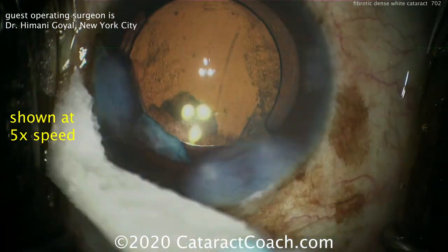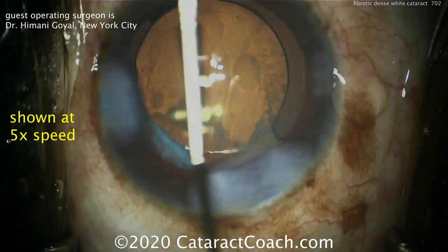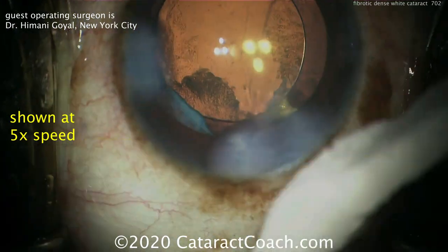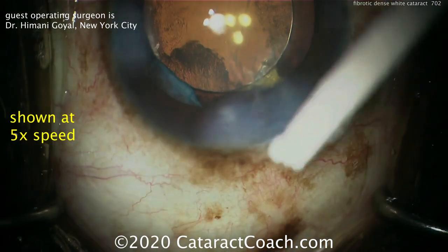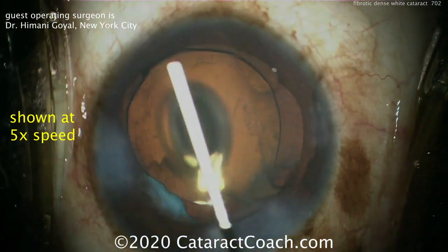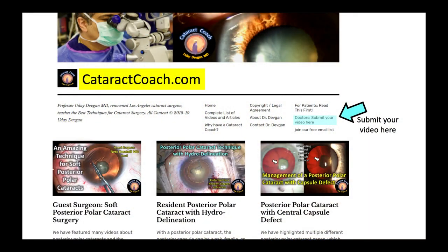After complete capsule contraction over the course of about two or three months, you can come back and do a conservative YAG laser capsulotomy if needed. The patient may have a little more post-op inflammation, so using steroids for a longer period of time is going to be useful. Thank you to Dr. Goyle for a very nice case — and you too can submit your cases at CataractCoach.com, our teaching website.